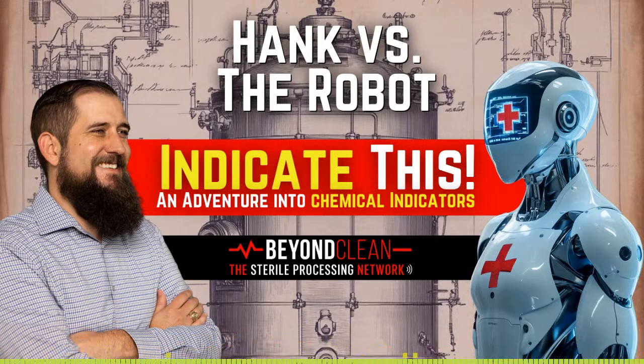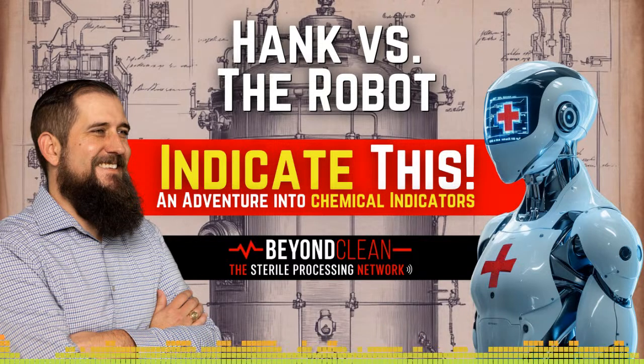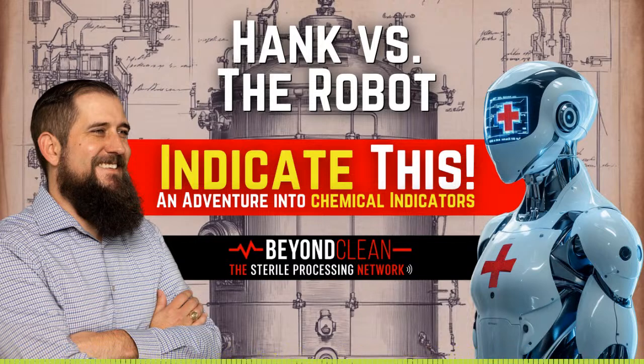Scenario 5, substandard products. While rare, products that aren't manufactured to regulatory standards or have quality control issues can lead to false passes. This underscores the importance of sourcing indicators and integrators from reputable vendors. To mitigate these risks, follow best practices like proper placement, monitoring sterilizer performance, using products before their expiration date, and training staff thoroughly on what pass should look like.